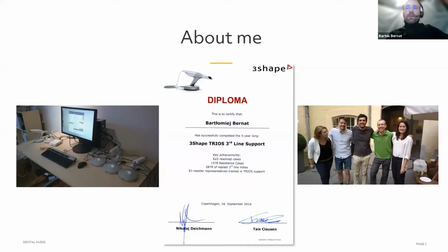Okay, so I'm going to tell you something about myself. I was working for the 3Shape company from more or less 2010 to 2016-ish, as you can see here. I was the first person assigned to the TRIOS project, and then I was doing first line support, second line support, and eventually third line support at 3Shape. This is my team here on the right. And on the left, you could see one of the early testing stations for the very early TRIOS 1 and 2 pod systems.